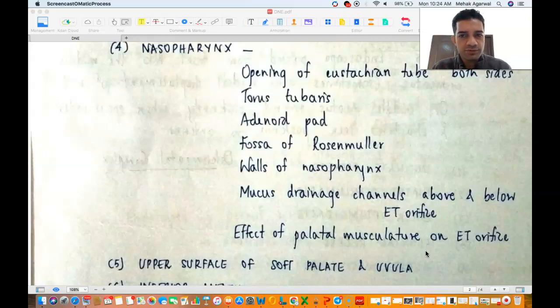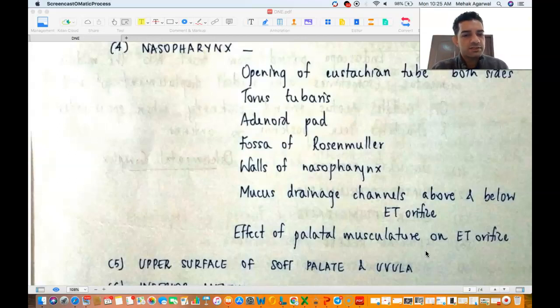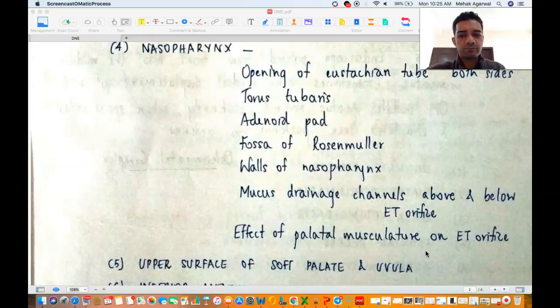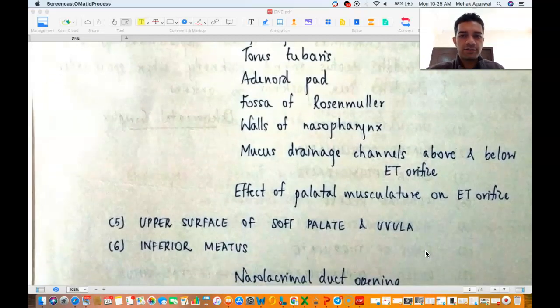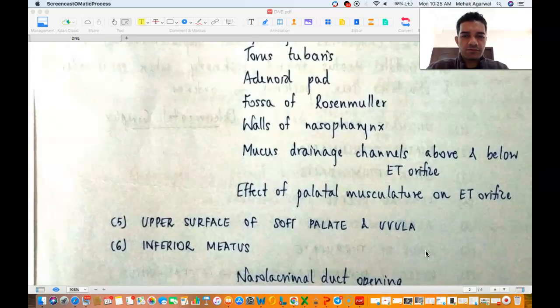So in the nasopharynx you see the Eustachian tube opening of both sides, the torus tubaris, the adenoid pad, the fossa of Rosenmüller, the walls of the nasopharynx, mucus drainage channels above and below the Eustachian tube orifice, and the effect of palatal musculature on the Eustachian tube orifice. The next thing you see in your inferior pass is the upper surface of the soft palate and uvula. You then see the inferior meatus when you withdraw the scope.